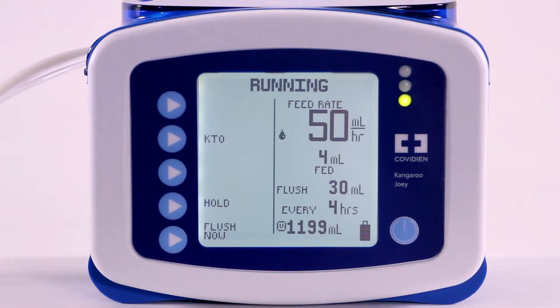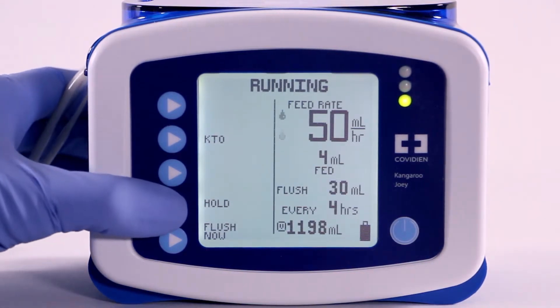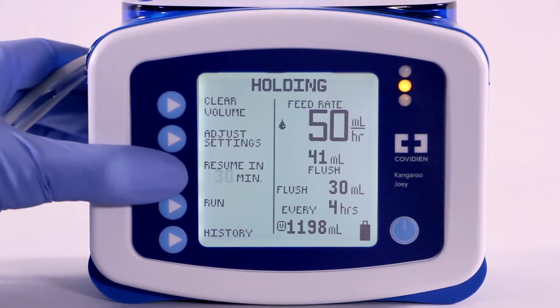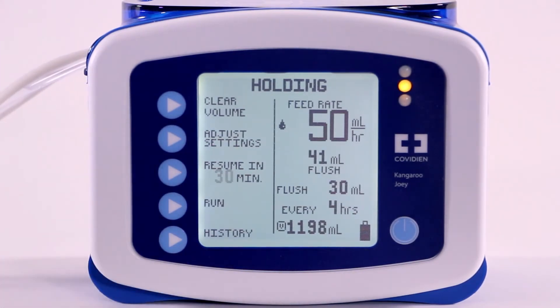To activate the Resume In feature, simply press hold during the feeding cycle, then select Resume In. The pump display will show Resume In 30 minutes.